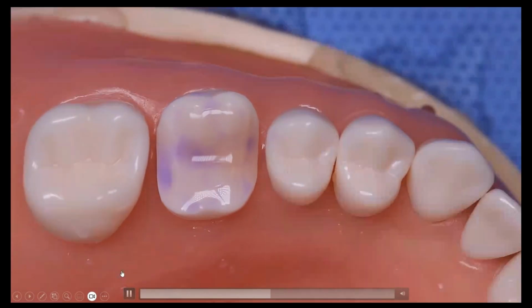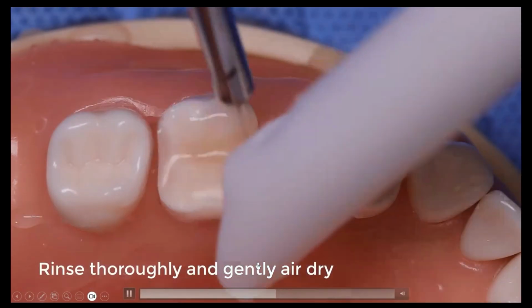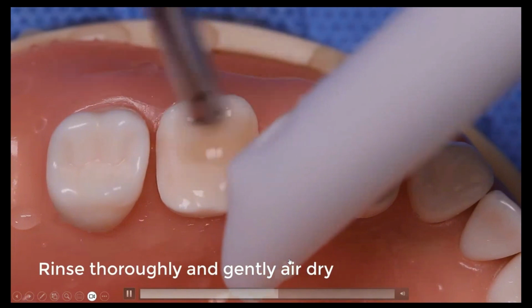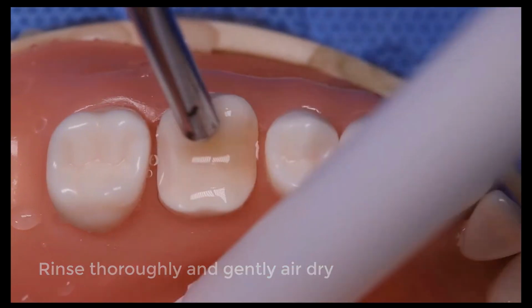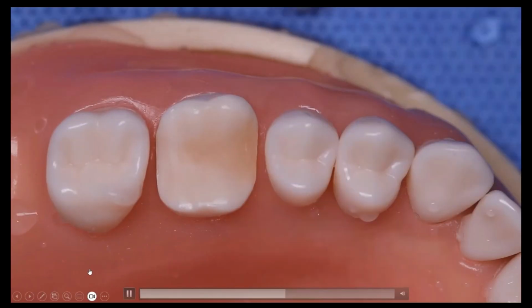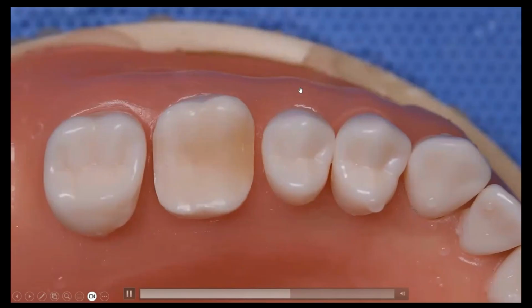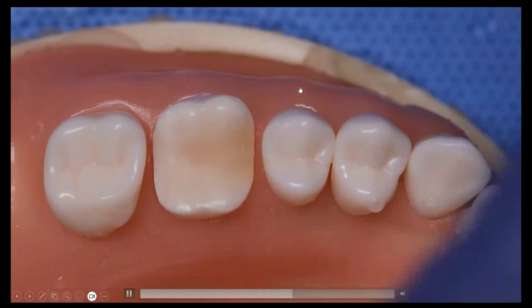Okay, so normally I have this under rubber dam. I'm a big rubber dam guy, and we're just doing this demo to show you. We're going to rinse this off. So now we've got our IDS resin coating, the temporary has been made, the impression was made, and now I'm going to send the patient home. Not like this, I'm going to actually spot bond. So pay close attention. This is a cool video.